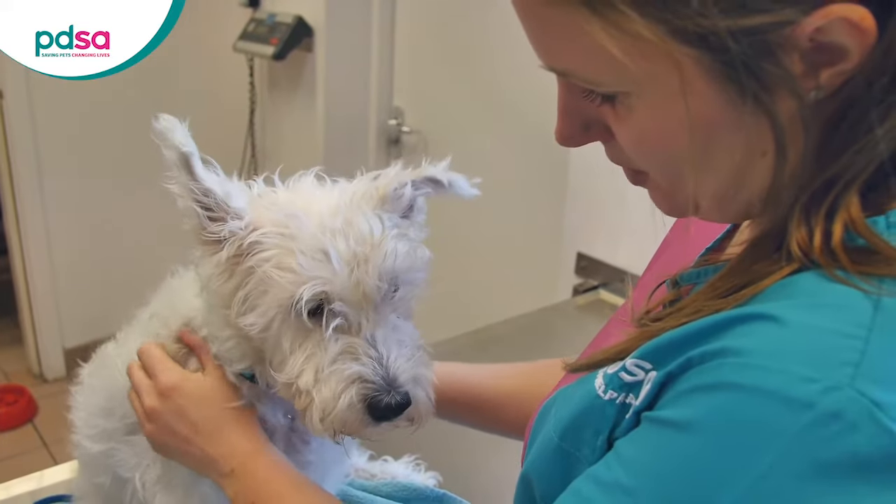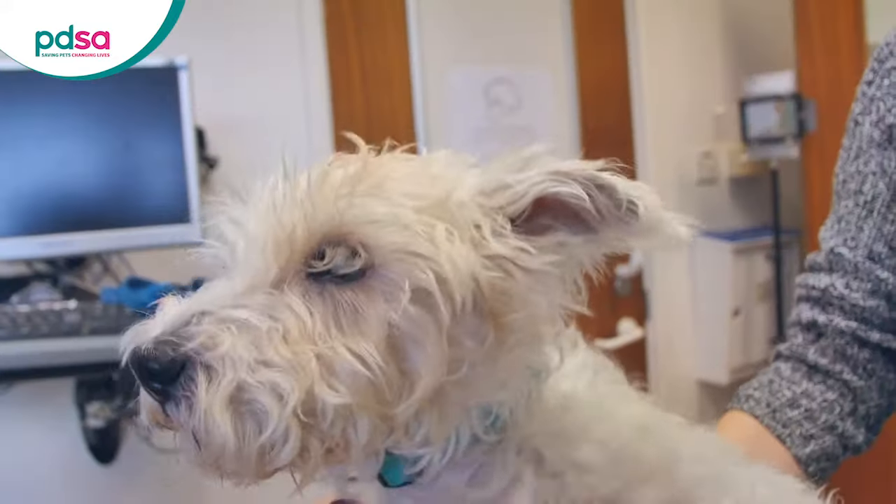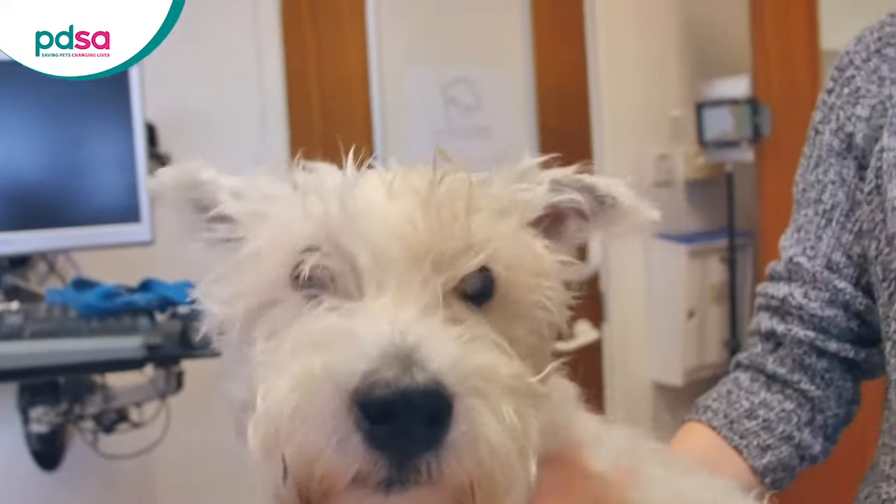After the injection give your dog something that they love — perhaps a big fuss or a toy. This means that hopefully they'll start to associate the injections with a positive part of their day. Treats aren't appropriate because that can raise their blood sugar which could be dangerous.